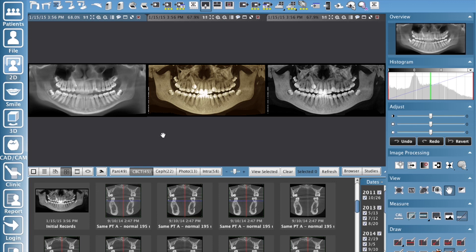So this is Romexis — how to create a pseudo pan from a 3D image. Hopefully this helps you, and enjoy Romexis.